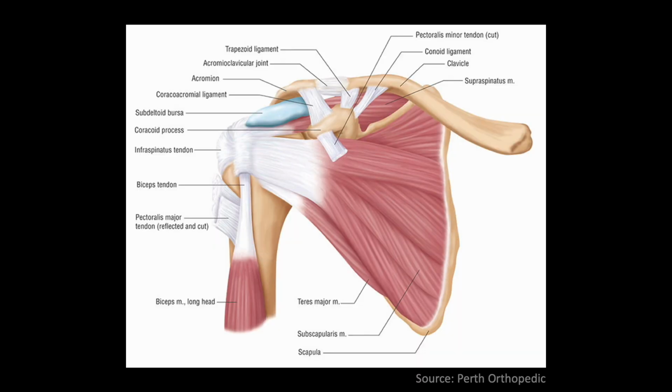Let's start by reviewing the anatomy and basic technique for scanning the shoulder. The shoulder girdle is comprised of three bones: the humerus in the upper arm, clavicle in the upper thorax, and the scapula posteriorly. Several ligaments connect these bones to each other, with motion allowed through the complex network of muscles and their tendons that wrap around the humerus and allow the arm to have a singularly wide range of motion.